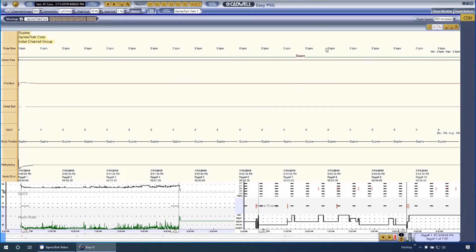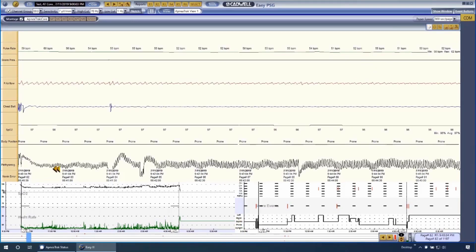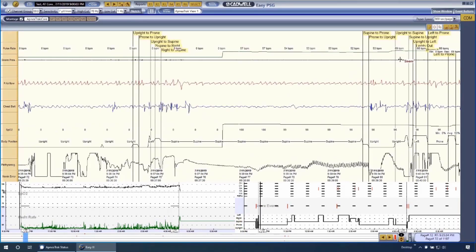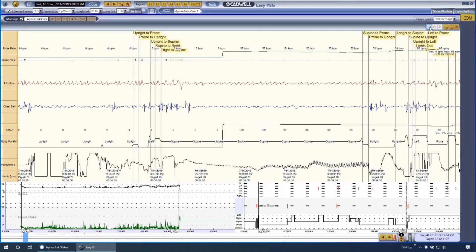You will be able to place markers for lights out and lights on to account for the time the patient wore the device and you will be able to see all instances in which the patient pressed the event button. You will also be able to score new events and edit events already in the record.